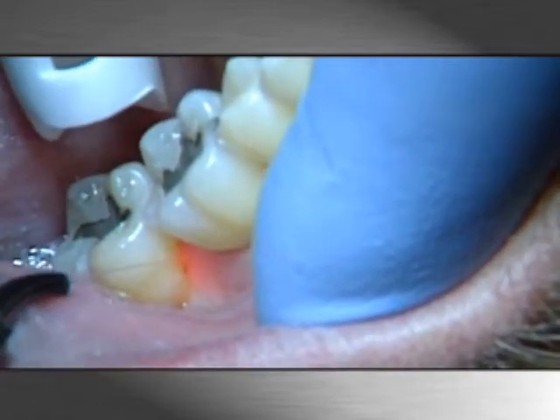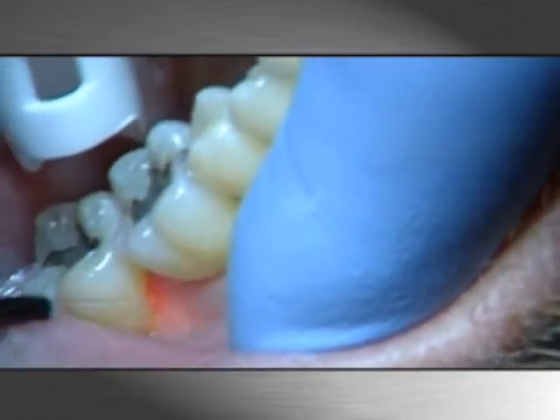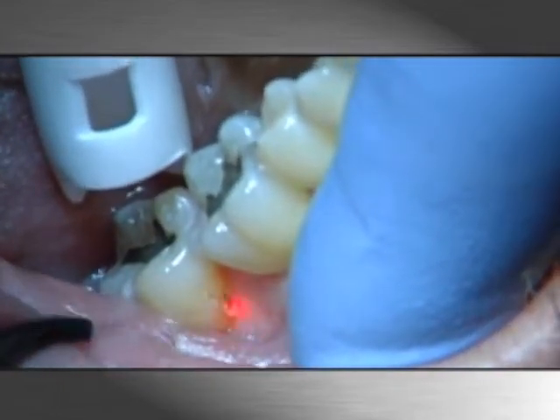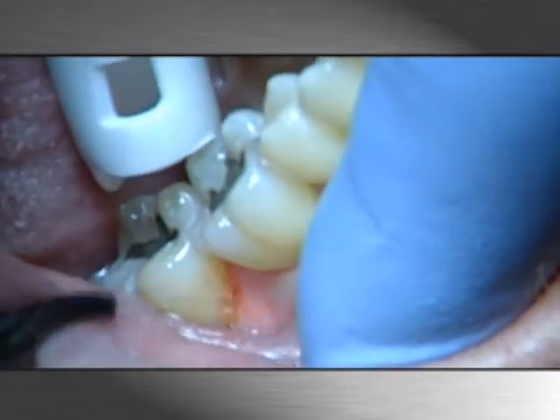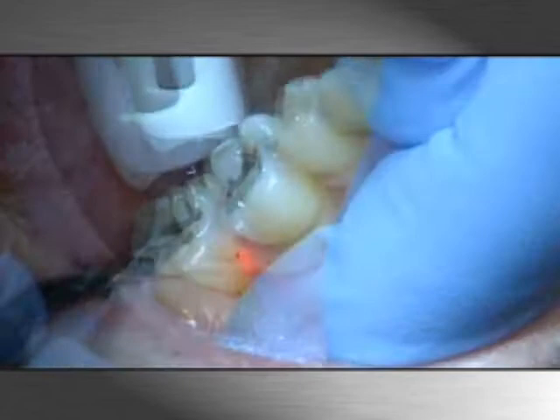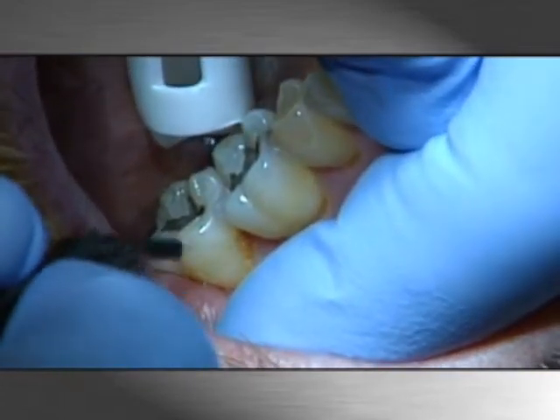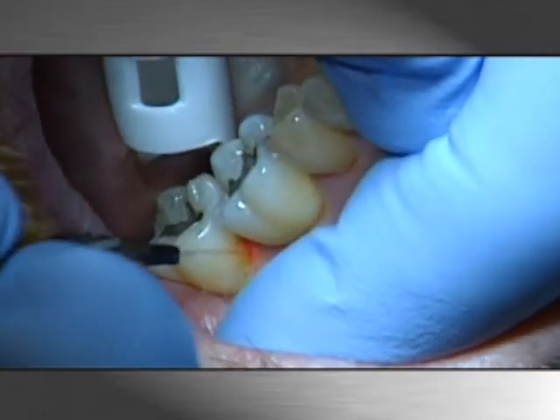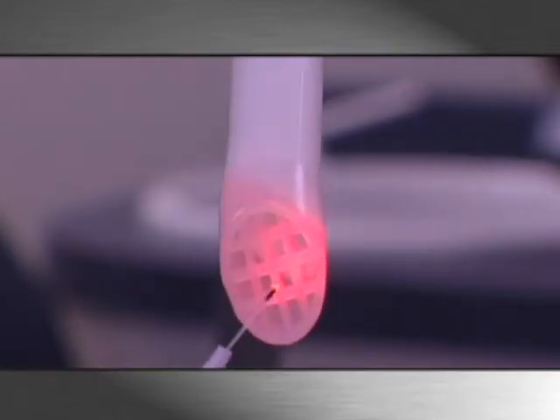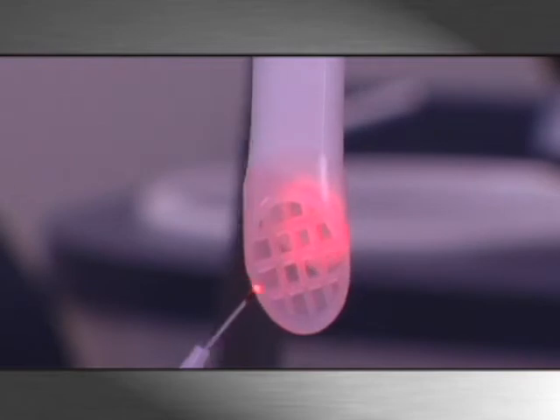Move the fiber in both horizontal and vertical directions, covering the epithelium and adjacent inflammatory connective tissue. Move the fiber smoothly and at a moderate speed. Debride all granulation tissue. You may use a fine water spray during laser treatment for rinsing. Remove plume and debris with the high-volume evacuation, which will also tend to cool the tissues and reduce the need for anesthesia.